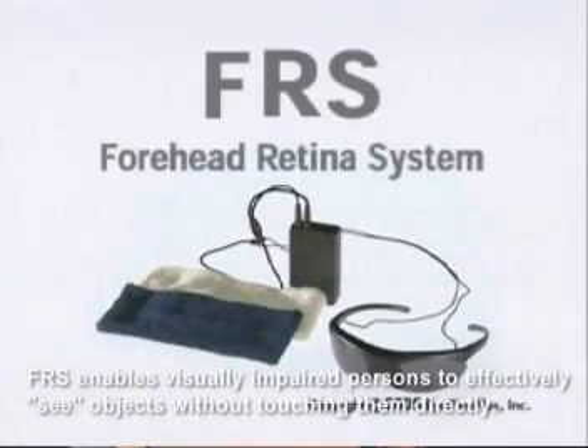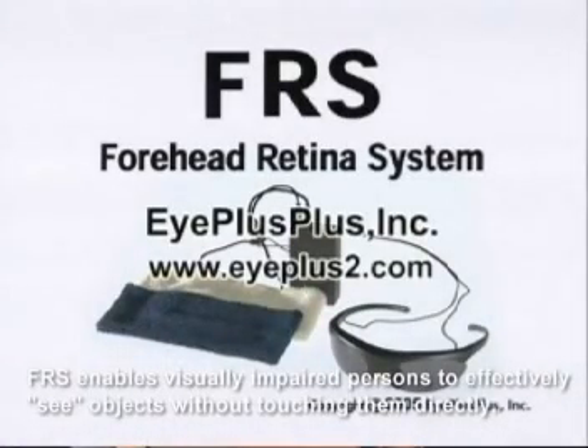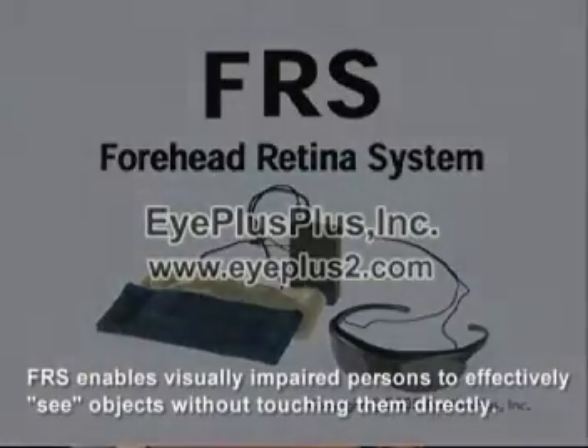FRS enables visually impaired persons to effectively see objects without touching them directly.